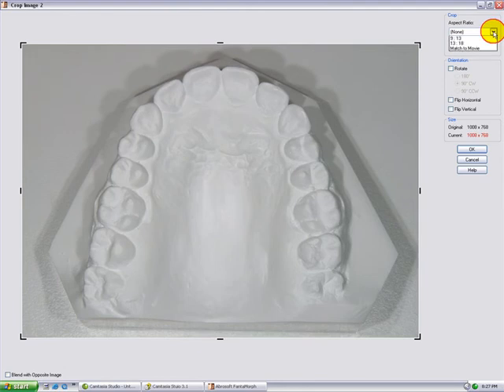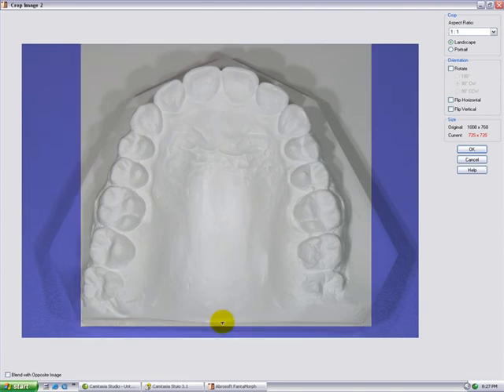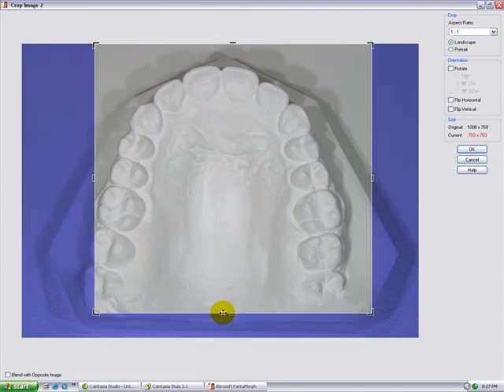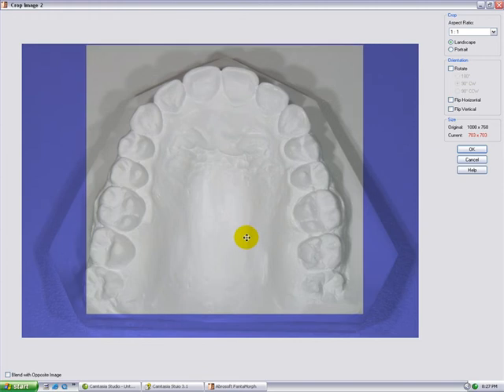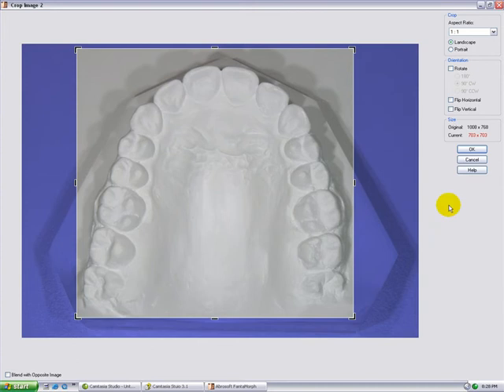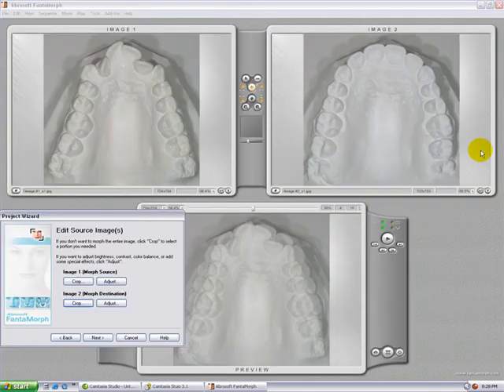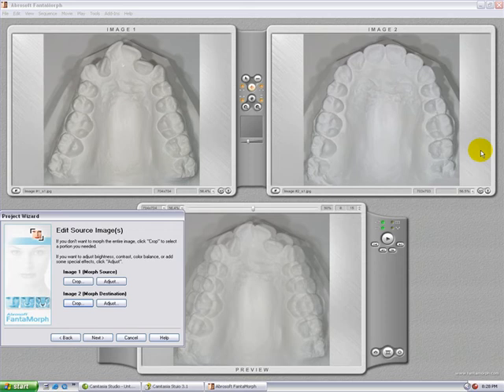Go for a fixed ratio again, 1 to 1 in this case. Crop the image and reposition. Click OK, and verify in the preview window if the position is correct.